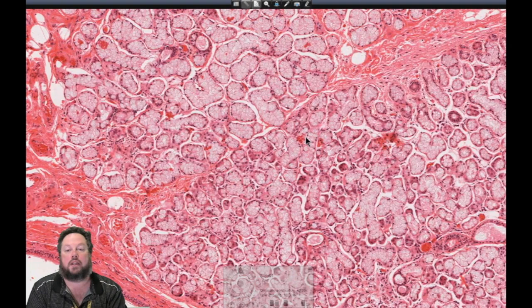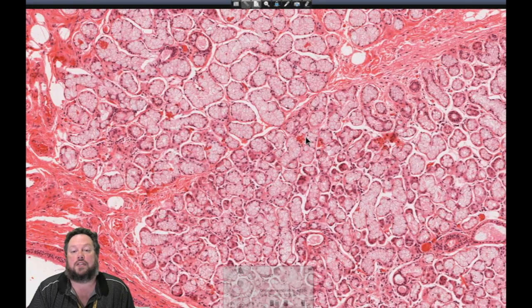You can create what I call a decision tree about whether you're looking at one of these major salivary glands and how you make the decision about what you're looking at. I've got some 3-minute histology videos on my YouTube channel if you want to check those out.